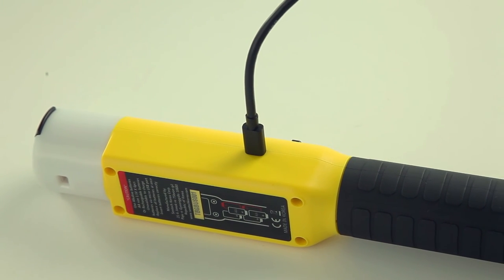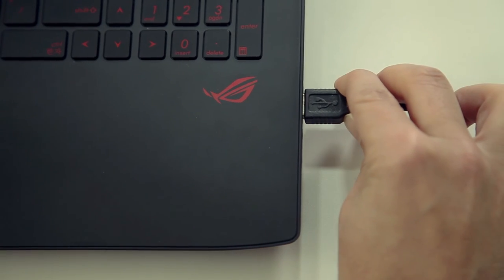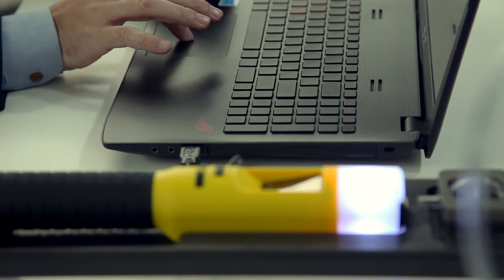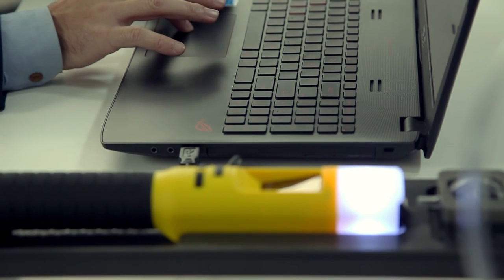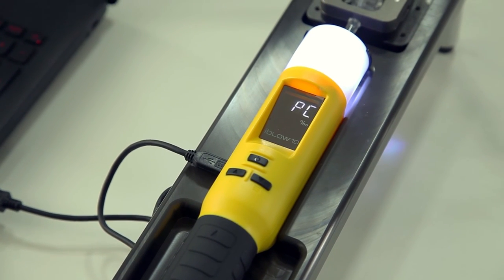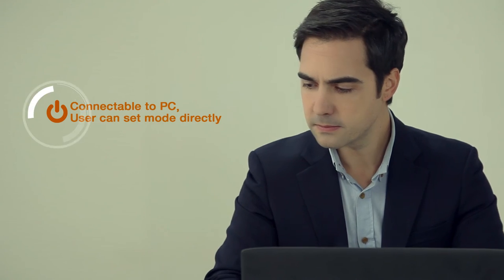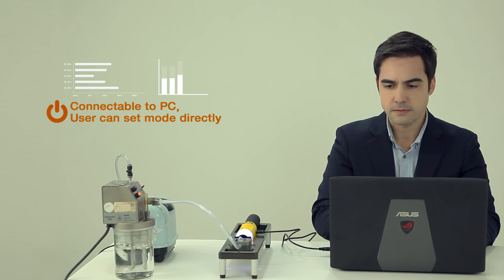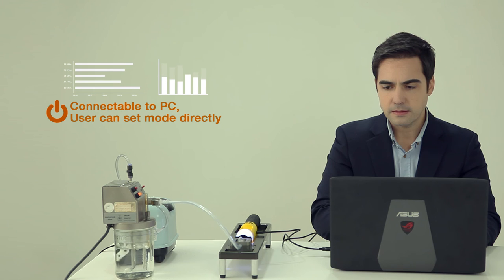The user may connect the iBlow 10 directly to a PC with a dedicated cable and access a dedicated software program that will allow the user to set functions such as calibration period or testing mode. It is convenient as the user can adjust and customize the functions according to their own situations.